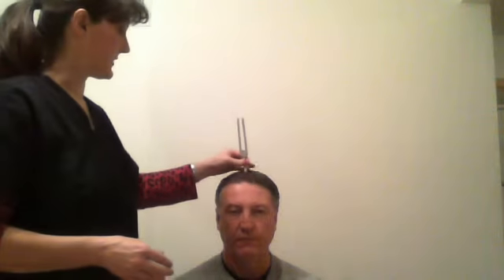So after looking in the ears, what I'd like to do next is a hearing test. The first test is called the Weber test. I'm going to check for sound conduction and see how Gary hears this. I'm going to put this on top of his head. Where can you hear the vibration? Both ears. Okay.